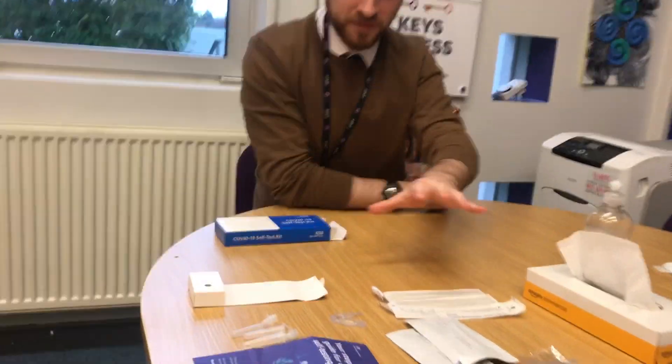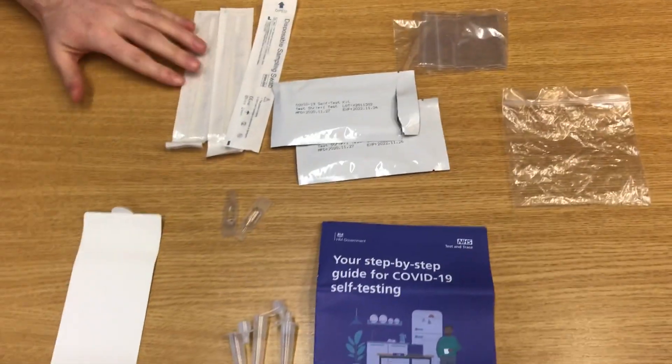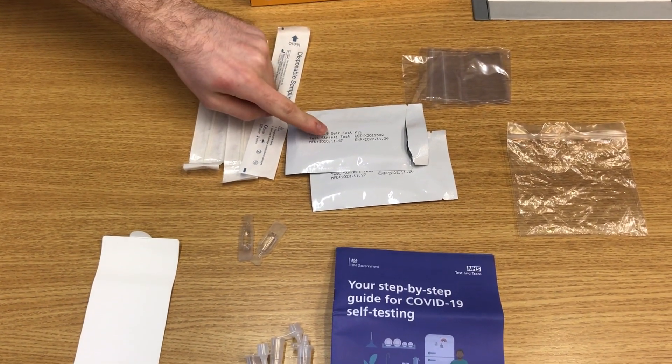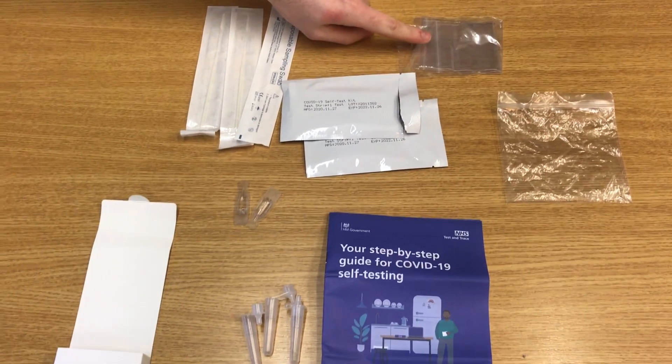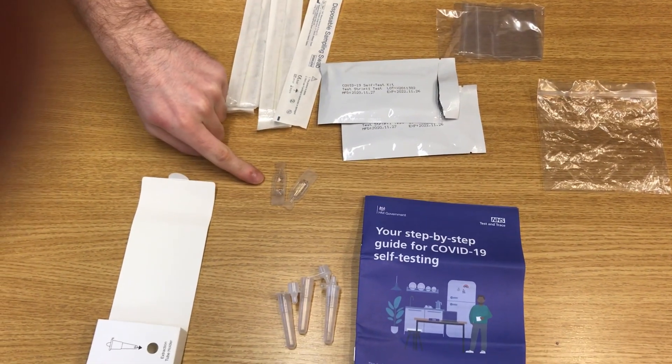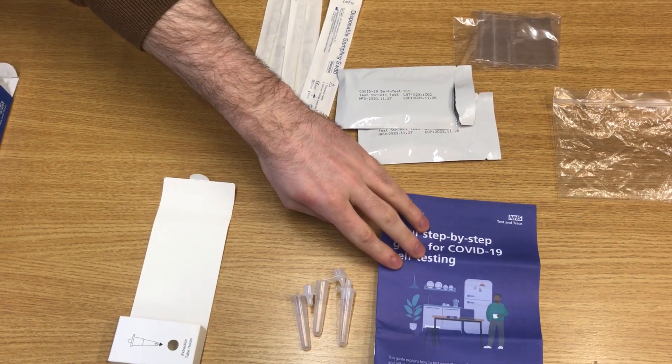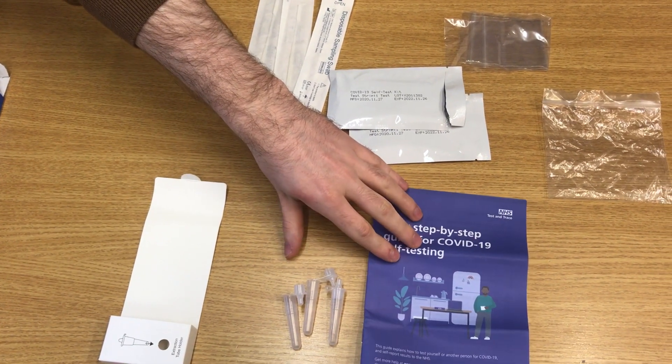Pretty soon your child is going to be receiving a box that looks a little bit like this. Inside is enough for three COVID tests, and we do ask that they go about completing that test at least twice a week. Inside the box you're going to find the following materials: the swab, the lateral flow device, a small plastic bin for wastage, the extraction fluid, the vial, and of course there's an instruction booklet as well so you can read over at home to clarify any misconceptions.